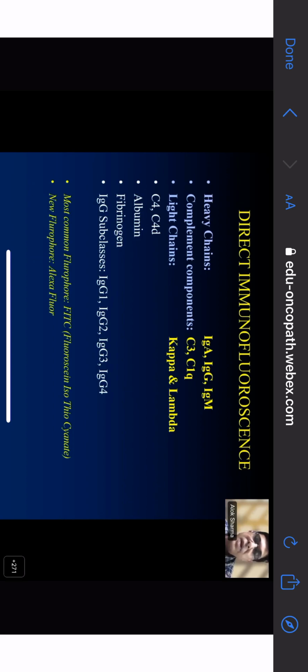That sample is cut under a microtome, just like you do for your frozen sections, the same microtome. Sections are taken on slides, and the idea here is to try and detect if there are any glomerular immune deposits. In fact, many of the glomerular or renal diseases are immune mediated. Our idea is to detect what immune complexes or what immune mediation is there in this particular case. That is why immunofluorescence has to be an integral part of each and every interpretation of the renal biopsy.